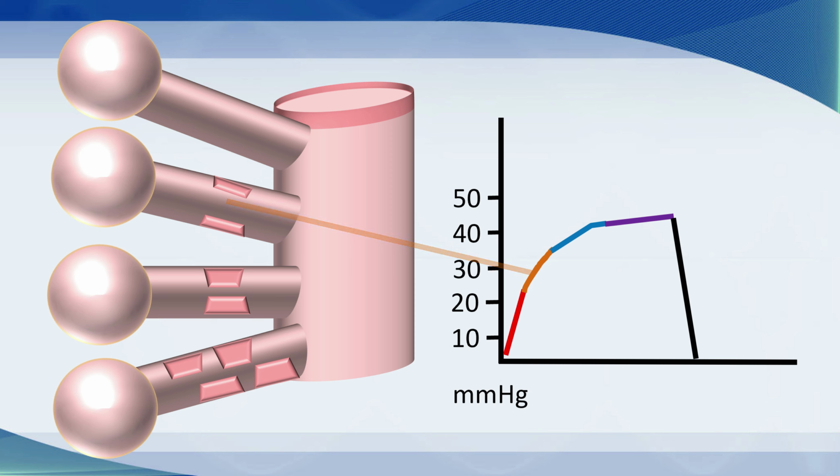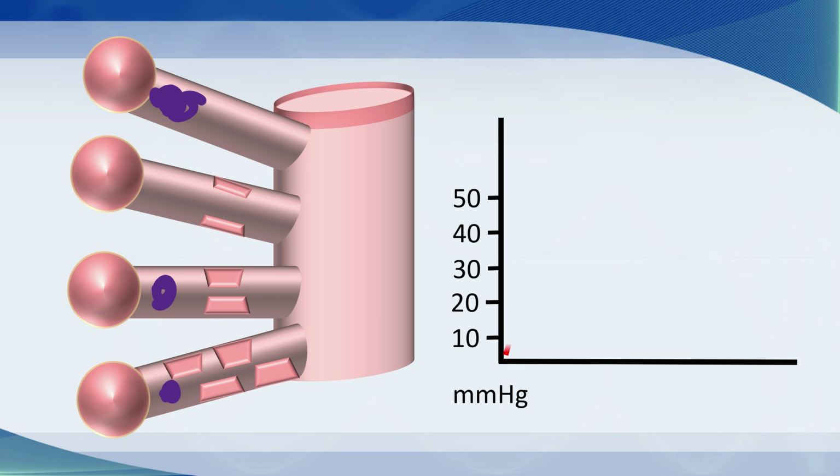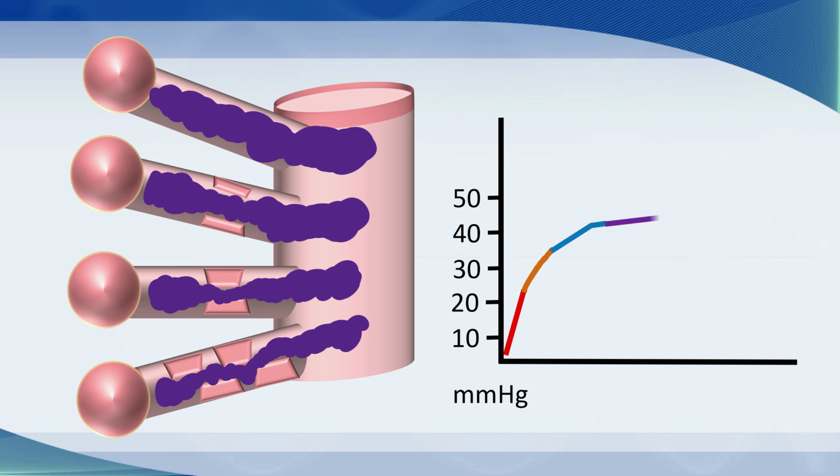And as we go along progressively, the third airway, very tight looking, difficult to get gas out of, and the last one has all kinds of stuff in it that is really, really applying a lot of resistance to exhalation. And so when the gas starts to try to move out of these airways, you'll see that in exhalation there are different rates of elimination of gas from these different airways, and that's why you get this really smooth curve that happens with a slow upstroke.